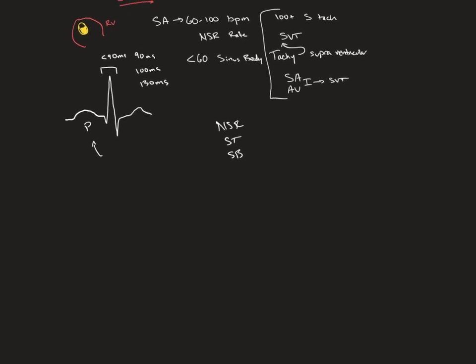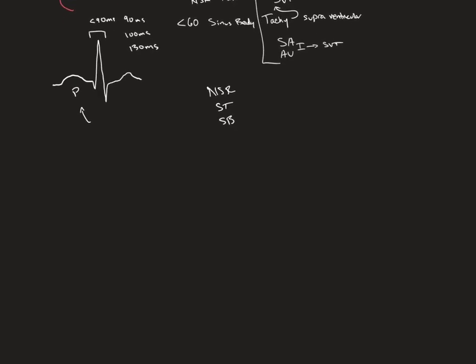This stuff is so hard to teach because it's super back in the memory, but you look at it and you're like, oh, it's sinus. So you'll start getting some funky P waves when you talk about junctionals and stuff. So let's talk about that.